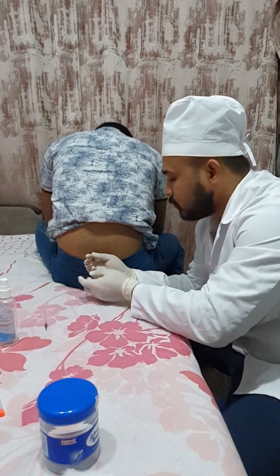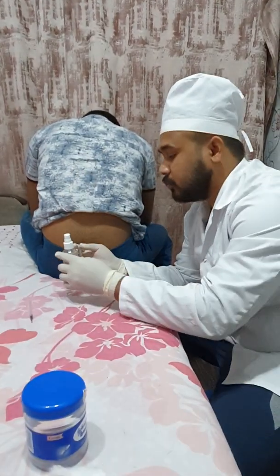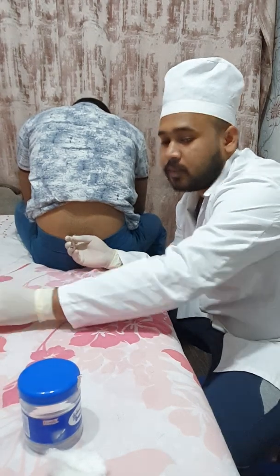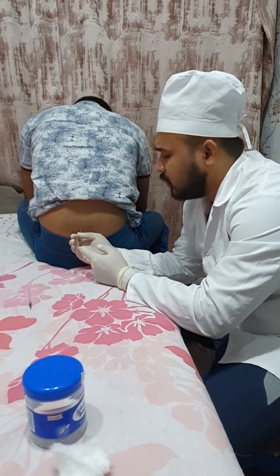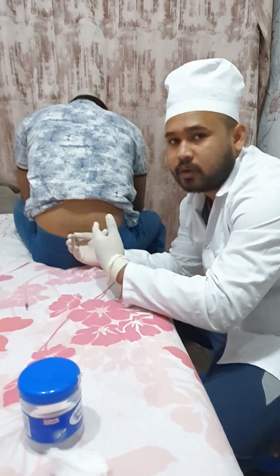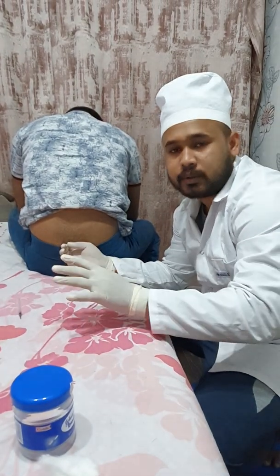So I will collect the CSF drops in a CSF collecting tube, and I will send it to the laboratory for further investigation. And through this CSF needle which is penetrated into the vertebral column, we can easily give any medication for any further treatment procedure also.